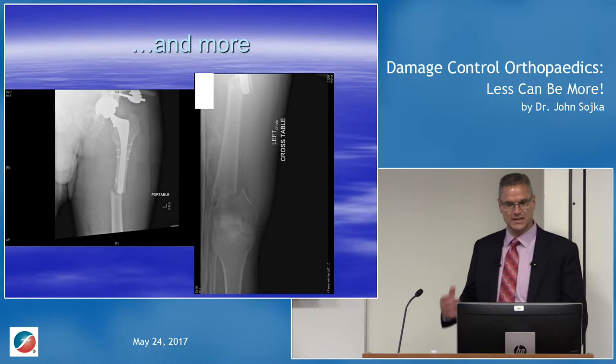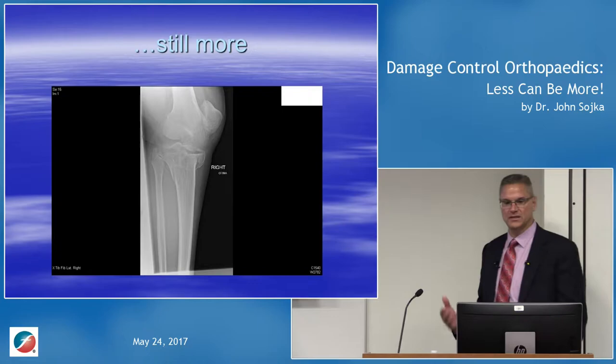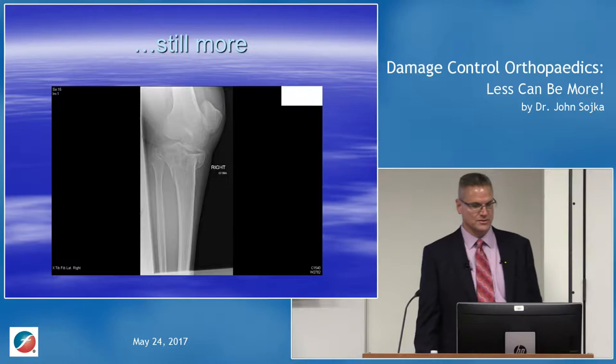This actually did have, you can't see it, but there's a drifting fracture fragment that goes into the joint there, but it's non-displaced at this point. So he's got a lot going on. Here's his tibial plateau fracture. Both medial and lateral condyles are knocked off. And then he's got comminution that goes into the metaphyseal region.